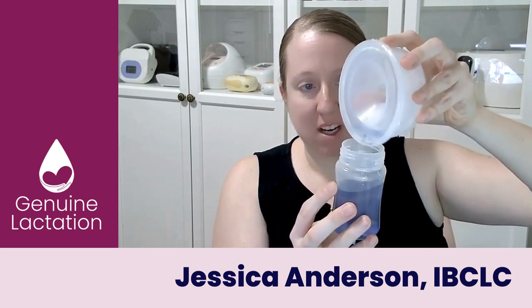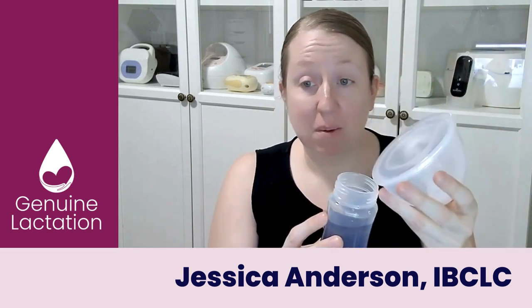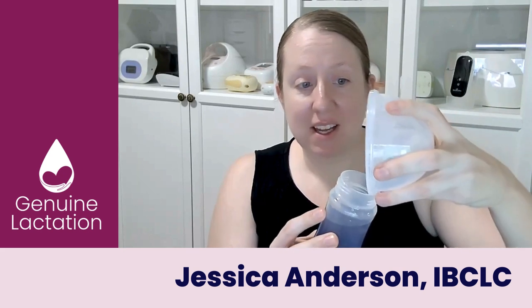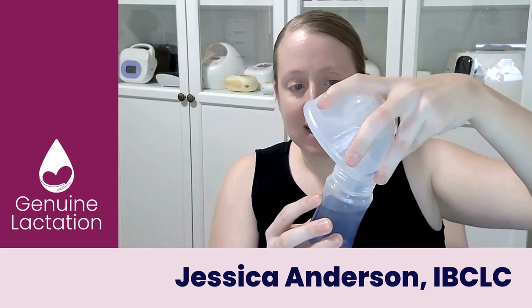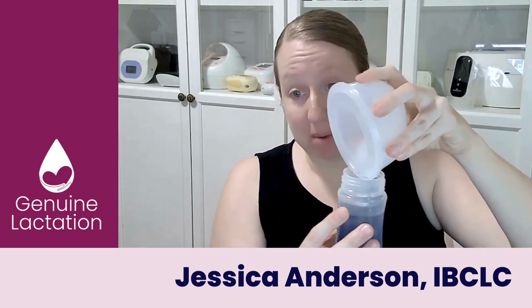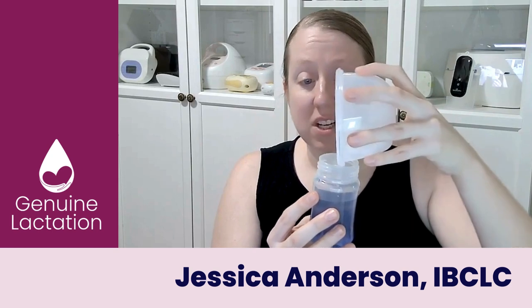Tap them out now that you've got the liquid down to a manageable level. Then what you can do at this point, if you want to be able to tap it more aggressively: take your cup and turn it sideways. Now you're going to get that last liquid out of there — that last liquid is out of the duckbill. The duckbill is clear. So now you're good to tap it a little bit more aggressively.